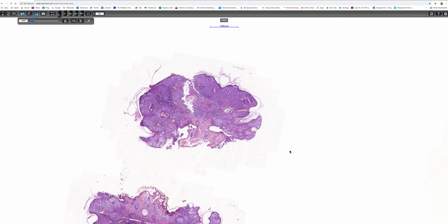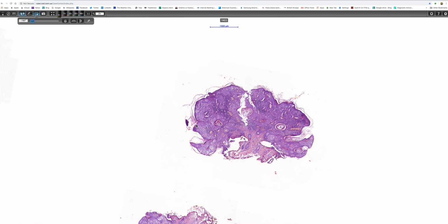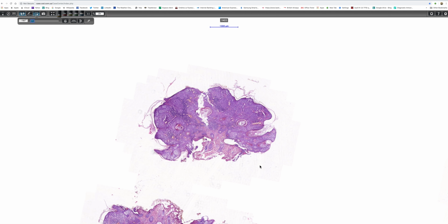And then we look for circumscription, which is essentially to see what there is at the edge of the lesion. And this is a bit difficult with this particular one because it's presenting as a polypoid structure, which is not uncommon, but it makes it a little bit difficult. But we can see nests there at this edge of the lesion, and I think we can make out nests at this edge of the lesion. So if we compare that bit with that bit, I think we can see that it is well circumscribed. Now, at this magnification, we can't really make much of the dermal component. It's not very obvious, but we'll see that when we look at it later. So at this stage, we know we're looking at a melanocytic lesion. It looks Spitzoid, it's symmetrical, and it's circumscribed. So those are all good things.